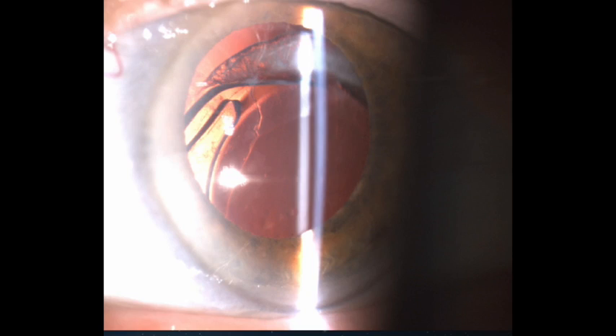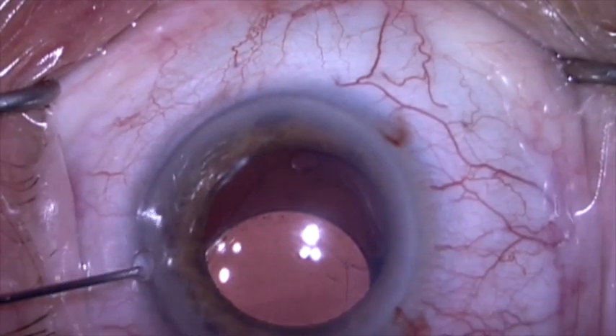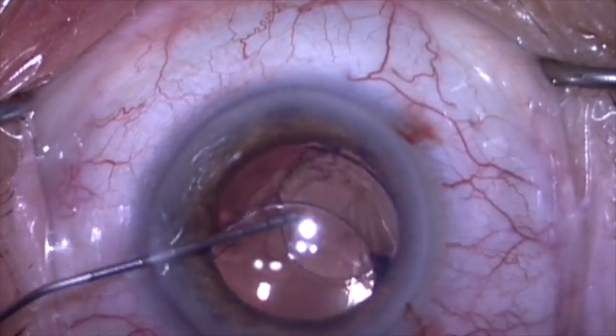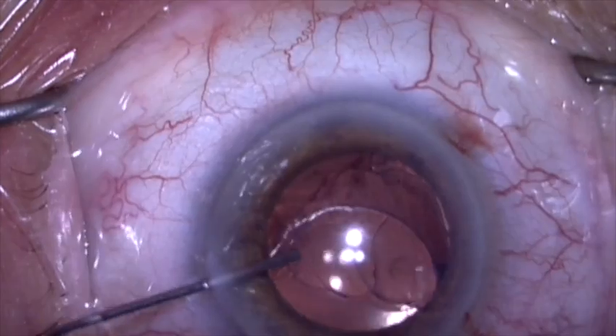This is a one-piece Acrysof lens that is dislocated along with the whole capsular bag complex. There's some vitreous herniated into the anterior chamber, so I'm going to displace that with some dispersive viscoelastic.